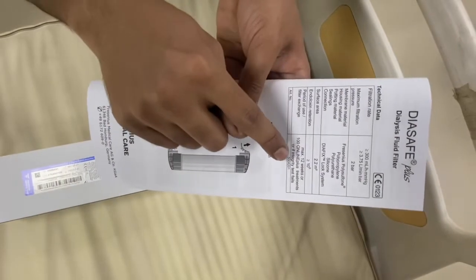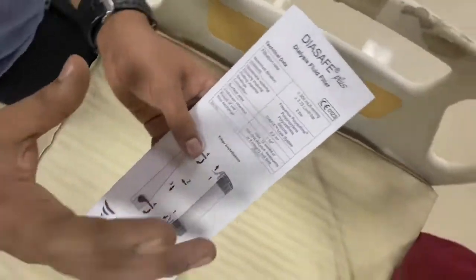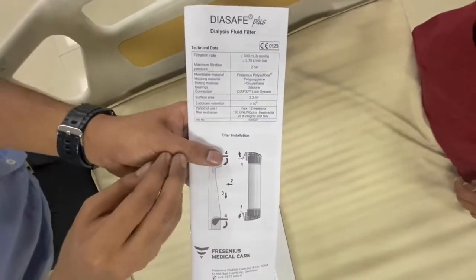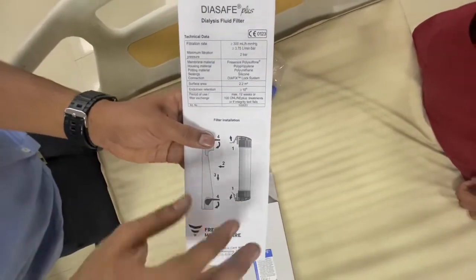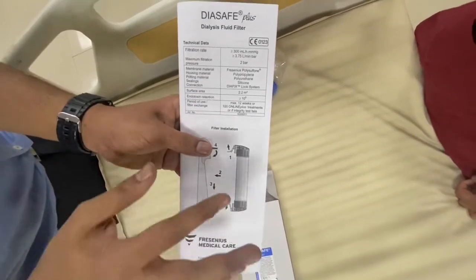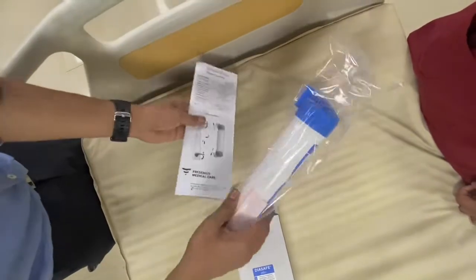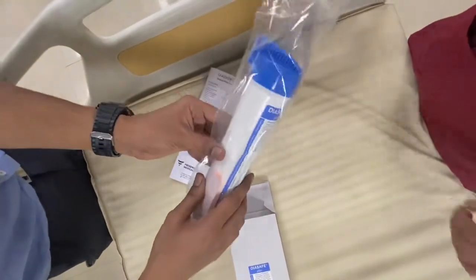The surface area is 2.2 meter square. It is mainly used for producing ultra-pure water. Even though the water coming to the hemodialysis machine is already purified under an RO plant, this filter serves as the final checkpoint to produce ultra-pure water.